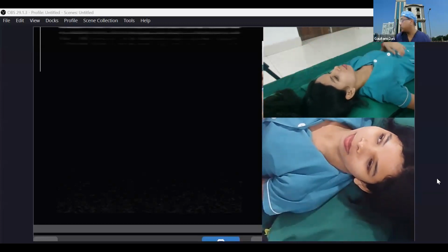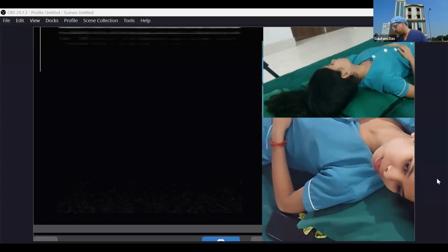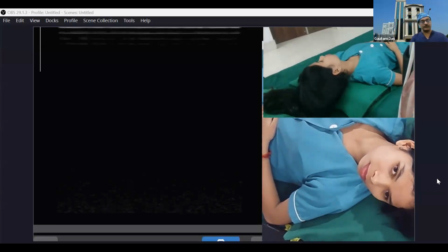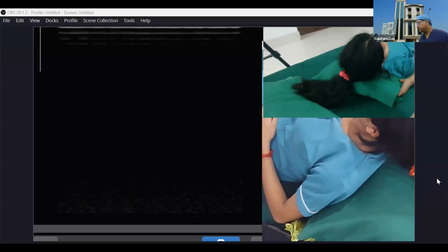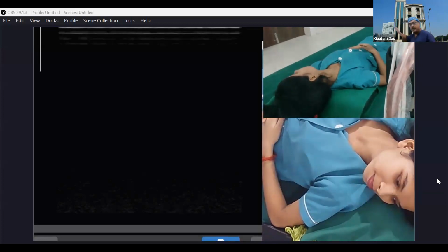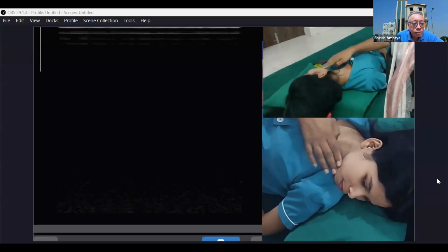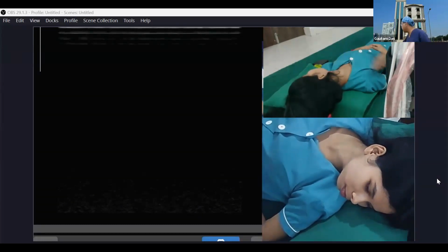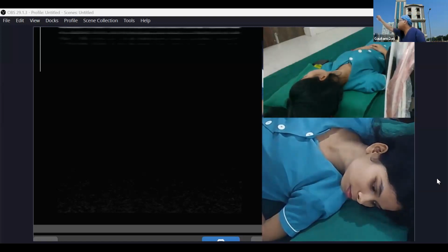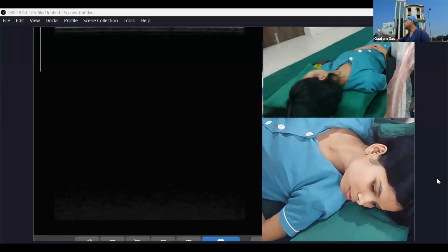Okay, so today also you're having two cameras, so that we can appreciate the structures better, particularly how I am holding the probe. So all of you can see the volunteer's neck nicely. Yes, sir. Okay, a little bit closer. So the probe will be a linear, high frequency linear probe.